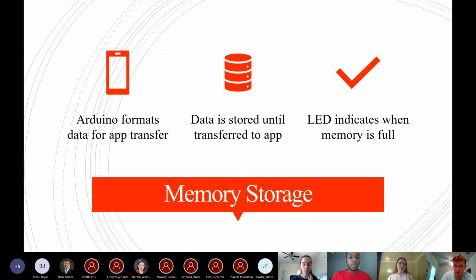And now for the memory storage section, we mentioned earlier that we're going to use the EEPROM and the flash memory to keep the data stored even if the device turns off for one session. It was mentioned also that one session will take about 55 kilobytes. That comes from the calculation that we're going to use unsigned integers to store all the counters I mentioned earlier in the last slide. And the data, like I said, will also be transferred by USB.